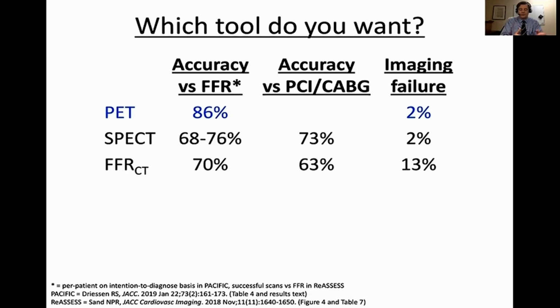imaging. When you think about renal function and contrast and just the ability to reduce the heart rate and get really good diagnostic CT images, those ones are something that just don't affect nuclear perfusion studies of either kind, both PET or SPECT. And so most patients, far more patients, are able to then get a diagnosis through perfusion imaging.